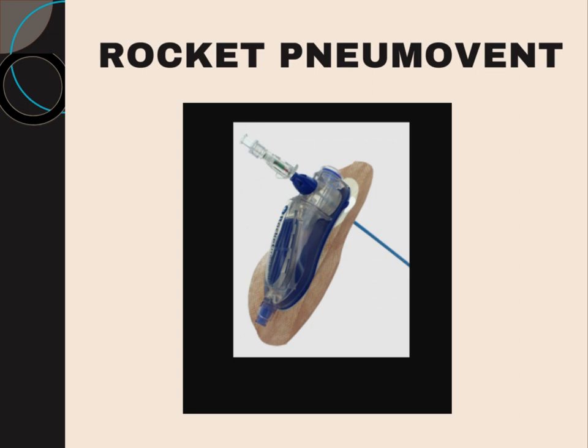I think it's very good. It's very small and excellent, and patients can go for shopping as well. Exactly. So it's a very nice tool. This is just attaching over here.